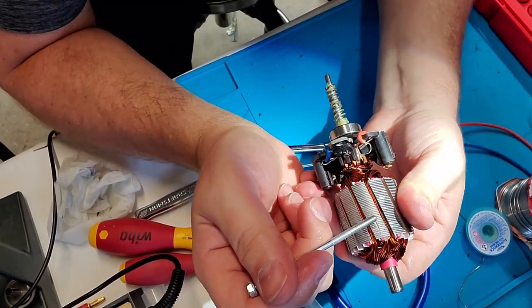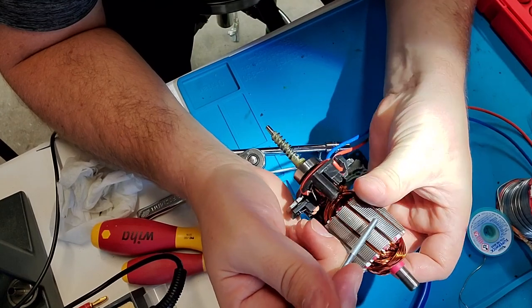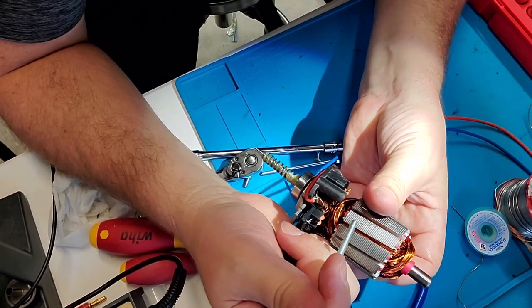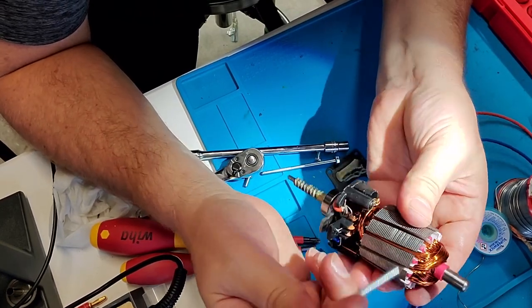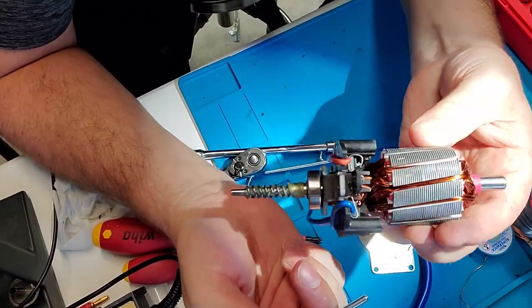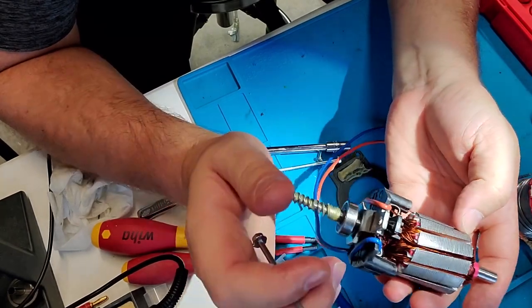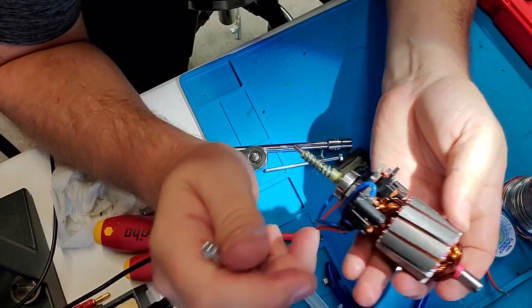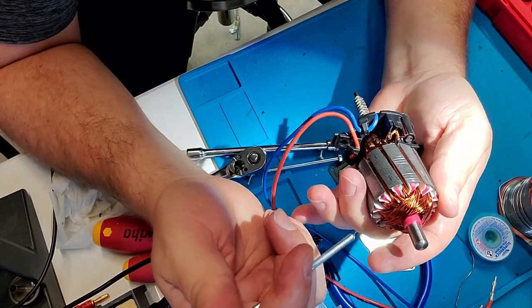You can see that there are grinding marks in the motor right here. And let's see, where's the other one? Oh, right here are little tiny nicks. Those are balance marks. What they do is spin this up on a chuck, and it tells them where to place grinding marks and how deep, how much material to remove. They do that to balance it because all things that rotate have harmonics. I've said that before. The way you get rid of harmonics or minimize them is to make it as balanced as possible. So even though there are just tiny little scratches like right here in the surface, that still removes enough material that it balances out the rotor. So yeah, look at that large grinding mark.